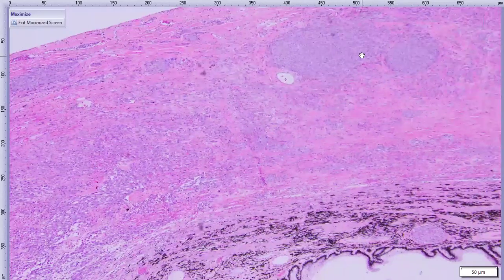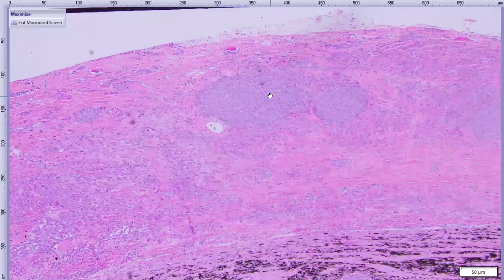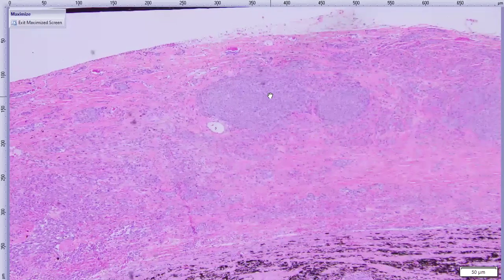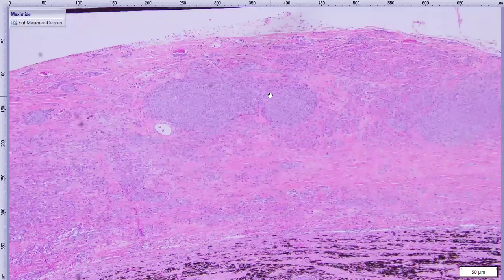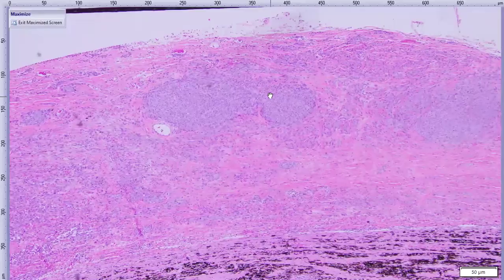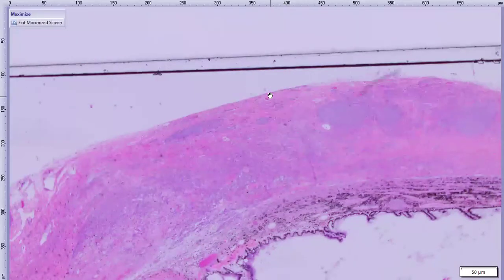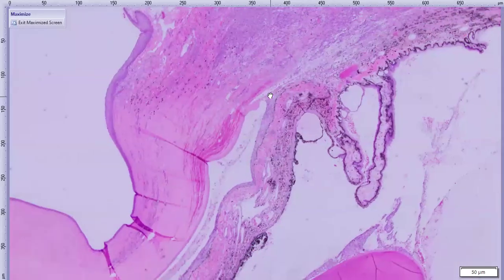So the fact that we have neoplastic cells in the scleral venous plexus also means that they're exiting the eye, because that's an exit point for the eye. So unfortunately, this dog has neoplastic cells that have arrived in the eye and now are also leaving the eye. So those are the main findings of the eye and the main event.